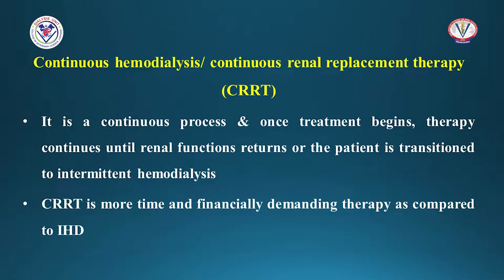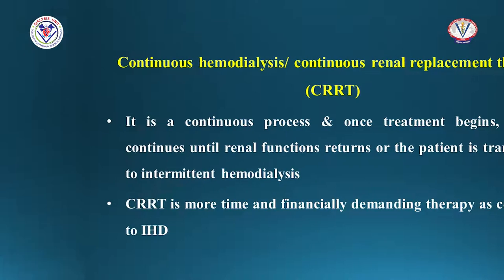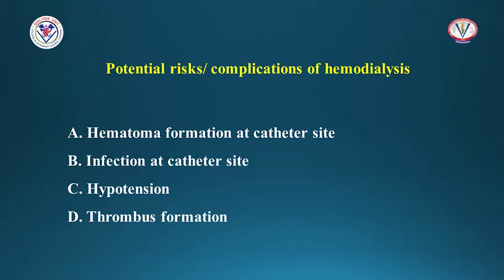Continuous hemodialysis, or continuous renal replacement therapy. It is a continuous process and, once treatment begins, therapy continues until renal function returns or the patient is transitioned to intermittent hemodialysis. CRRT is more time and financially demanding as compared to IHD. Potential risks and complications of hemodialysis include hematoma formation at the catheter site, infection at the catheter site, hypotension, and thrombus formation.